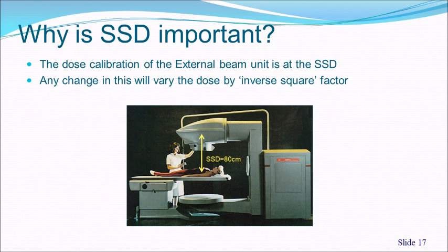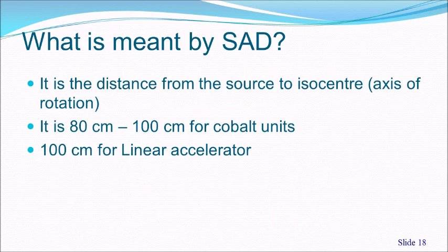Why is it so important? Because the dose calibration for an external beam unit, most of the time, is done at that SSD. Any change in this would change the dose by the inverse square factor. And this becomes the reference for that machine, right?